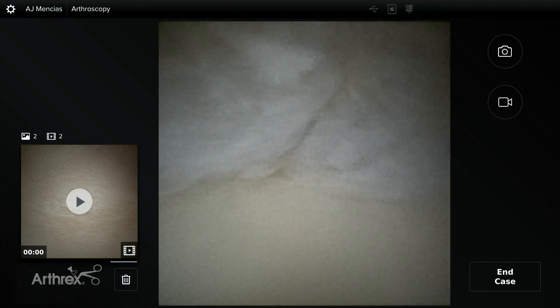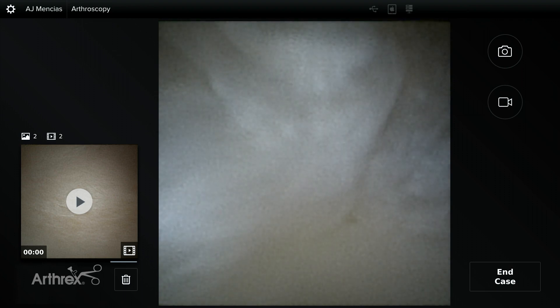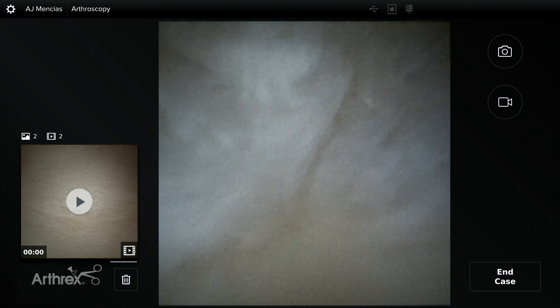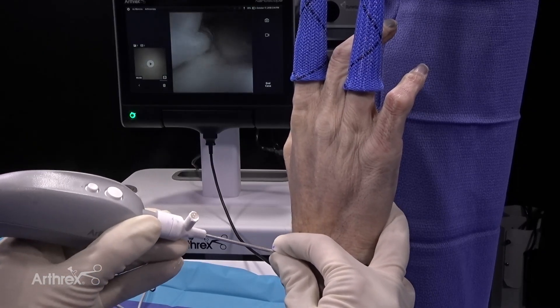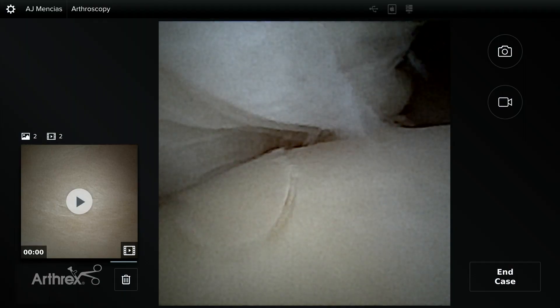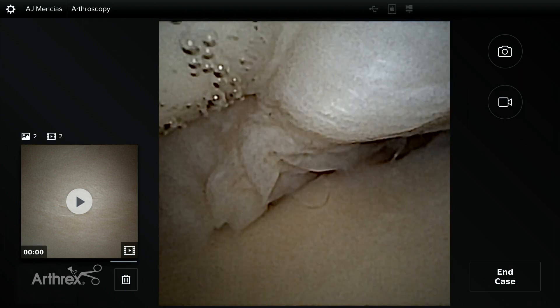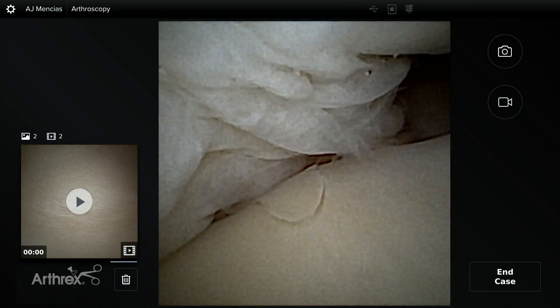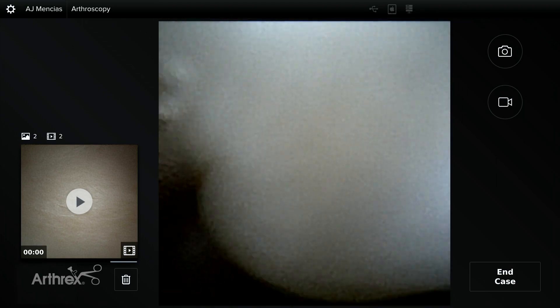Those are vital ligaments for carpal stability, and honestly I don't think you can get that close to those ligaments with standard wrist arthroscopy with this kind of detail. Inside that synovium is probably the ligament of testut, which is kind of a neurovascular structure that supplies the scapholunate ligament, and right here you can get an unbelievable view of the scapholunate ligament. Coming up here I'm looking at the volar portion, the membranous portion, getting to the proximal portion of the scapholunate ligament, and up here I'm getting into the dorsal side of the scapholunate ligament.